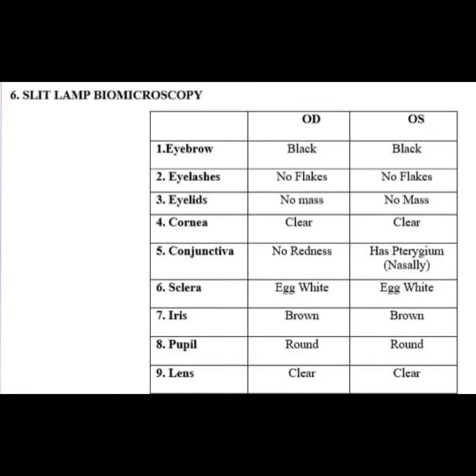Number 6, slit lamp or biomicroscopy. First, eyebrow, OD, OS black. Second, eyelashes, OD, OS no flakes. Third, eyelids, OD, OS no mass. Fourth, cornea, OD, OS clear. Fifth, conjunctiva, OD no redness, OS has pterygium nasally.